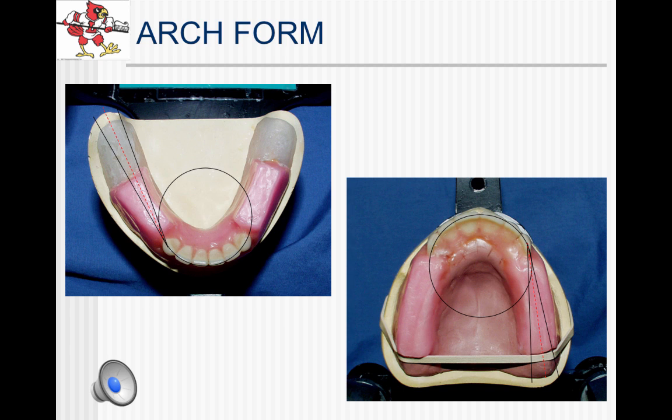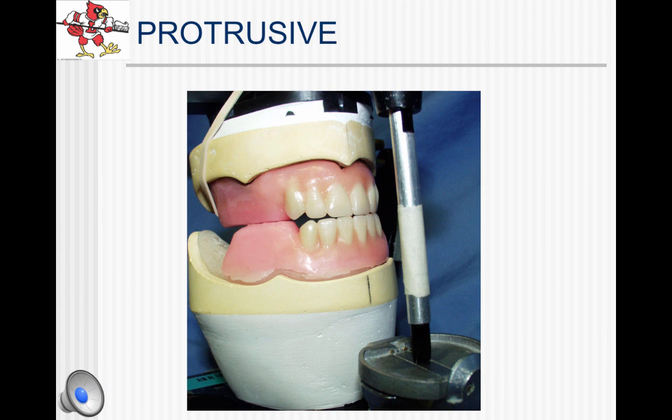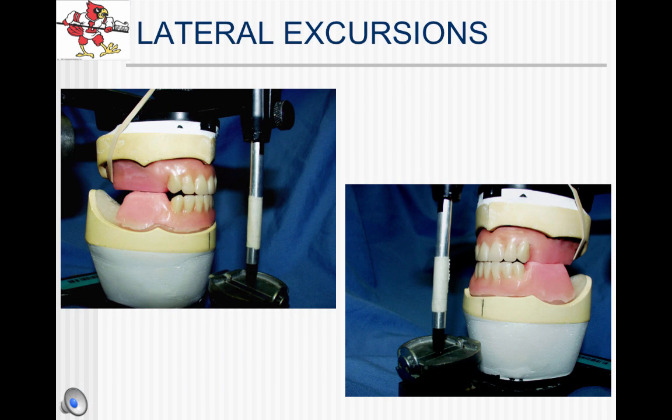When you look at the maxillary and mandibular arch forms above that are developed for the setup, the middle groove of the posterior teeth will be set along the red lines that have been established on these designs. In protrusive, the teeth should have kissing contact. Please note how nicely the casts have been cleaned up, as well as the occlusion rims and the wax around the teeth. There will be kissing contact on lateral movement also.